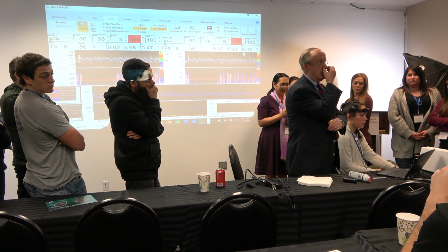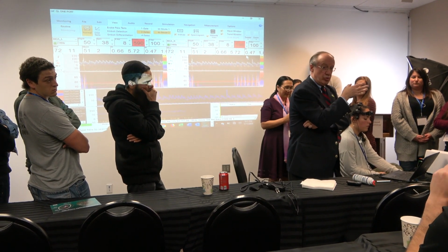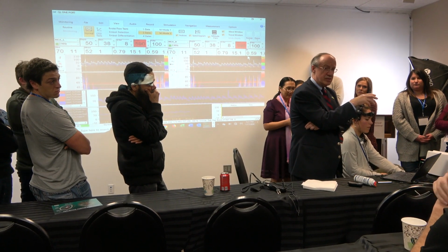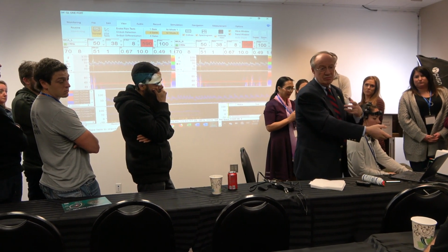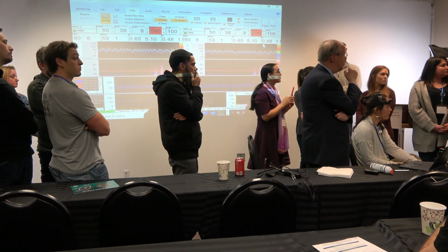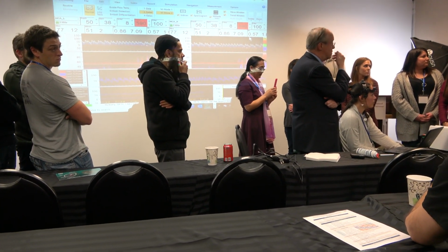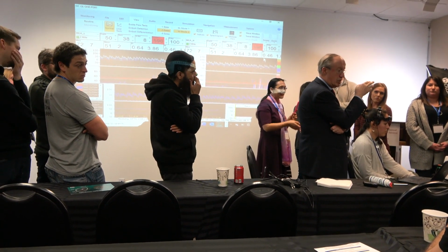And in my former place of work at Hopkins, I do know that now for all stroke patients, they put bubble TCD as standard test for stroke patients. So patient arrives, it is IV, 10 minutes test practically. Dr. Spencer, he published some papers on using the bubble test for migraine. Right. PFOs. It is another very interesting area, but not very well developed.